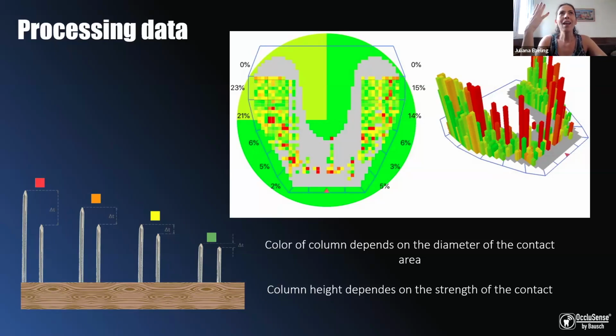But how can I know which is a real contact and which is not? When we have the transferable colors in the mouth, when we start the registration, the real contacts are registered with colors in the mouth. So we can look at that and correlate this data with the graphic. This is a way to start to understand how to use so much data that we receive.